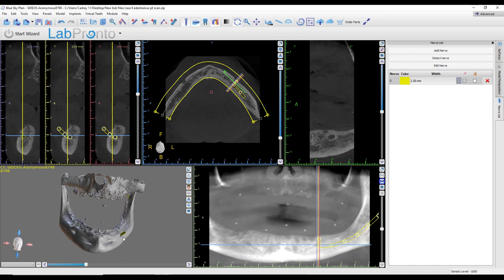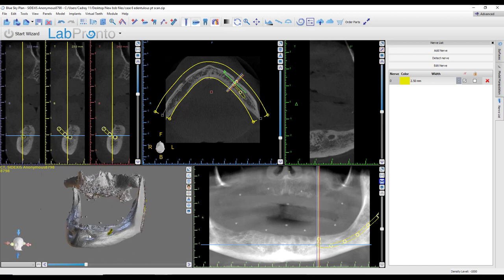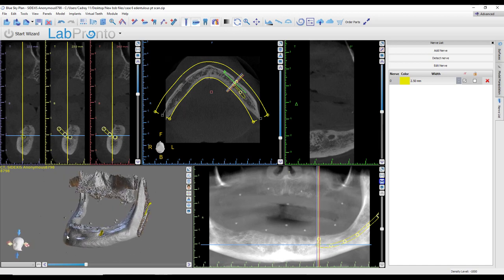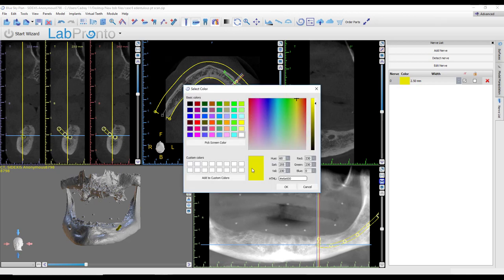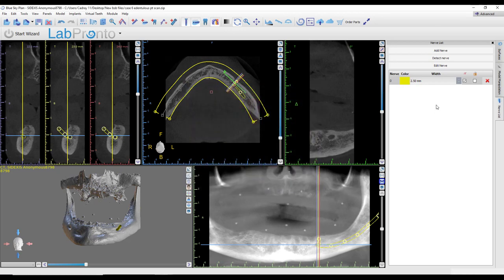What if that doesn't work? Well, we could come back and do the manual nerve stitching. Let's delete this nerve. Before I do, I'll make note: if you want to change color, you can do that here — click on the color swatch, make it whatever color you want. If you want to change the diameter of the nerve, highlight this number and change it. If you want to lock the nerve, you can do that.